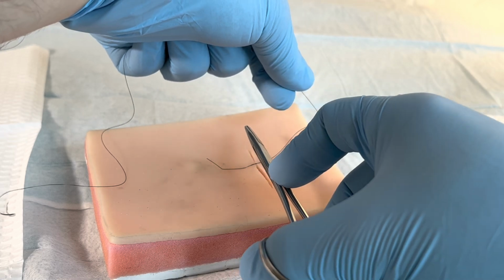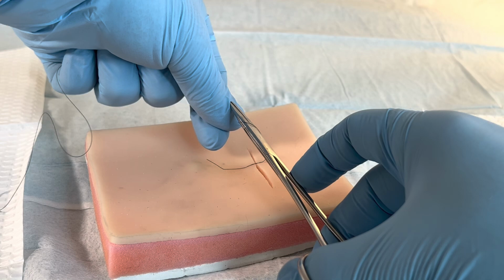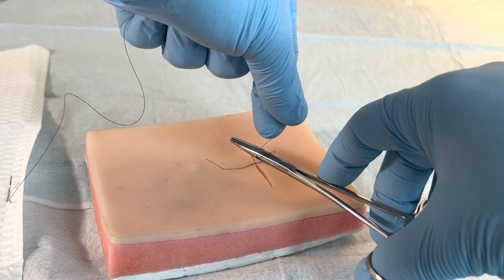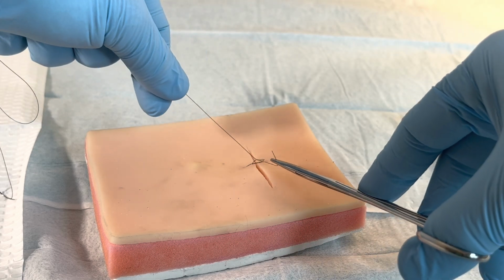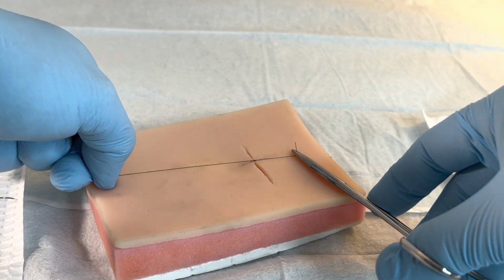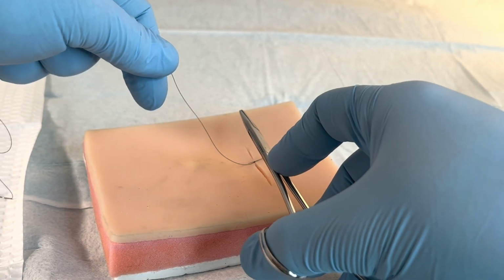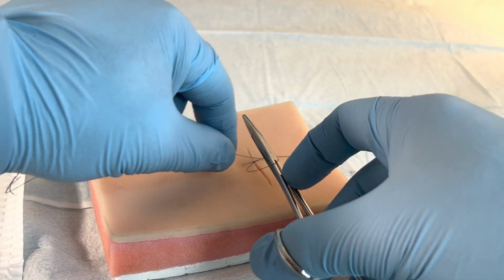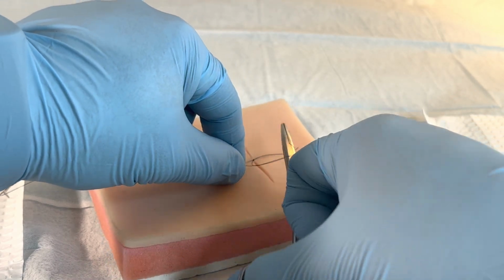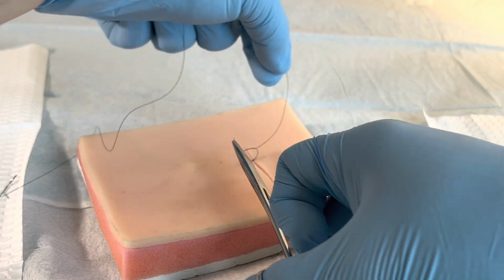Instrument tie, parallel to the wound, over the wound. Grab the lead end, throw it over the instrument. All subsequent knots are just 1 throw. Grab the tail, and arms switch to opposite sides. So pull across. And we repeat. Instrument, over the wound, parallel to the wound. Lead edge, throw once over the wound, over the instrument. Grab the tail. Pull through, and arms switch sides.